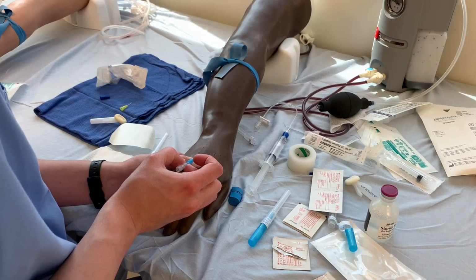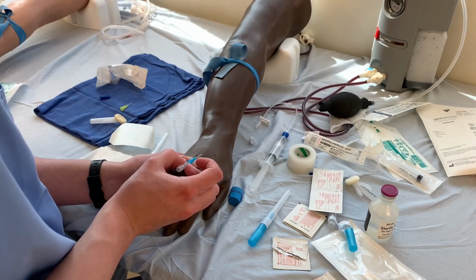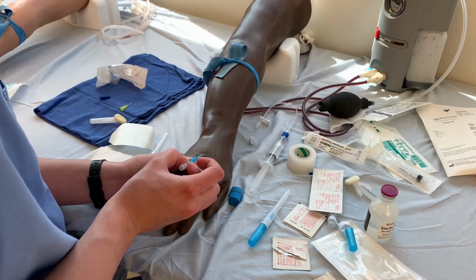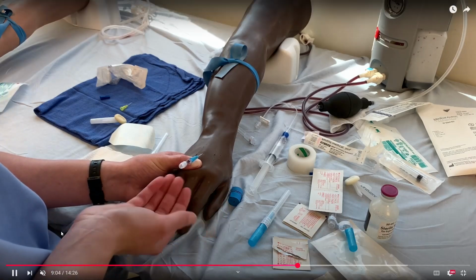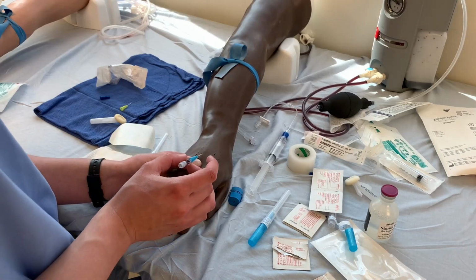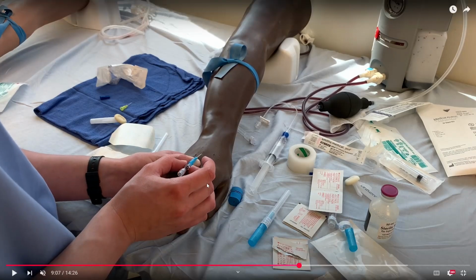So shallow angle, going in my insertion site, slow but steady advance. Bam, there it is. Right there. Now, the textbook way to do this is to drop your angle, insert a little bit more, and then with the free index finger, slide the catheter off of the needle. That way it's a one-handed operation.